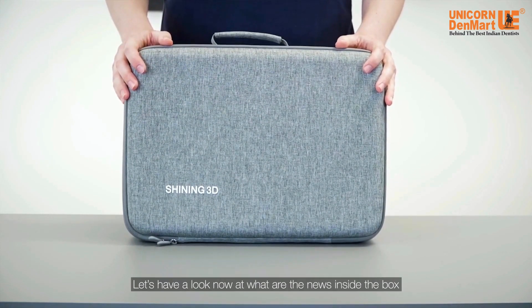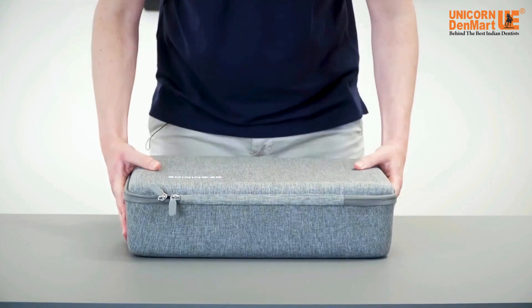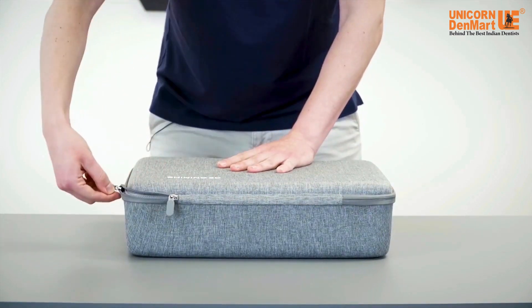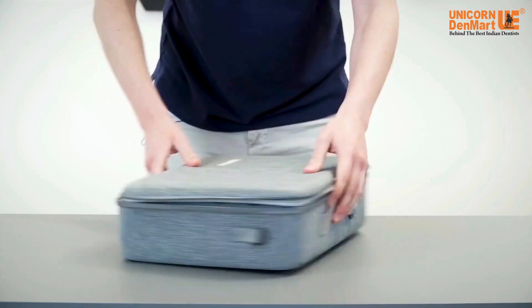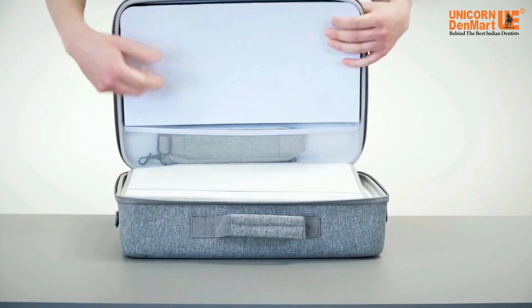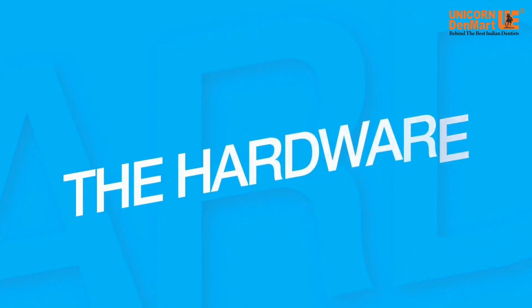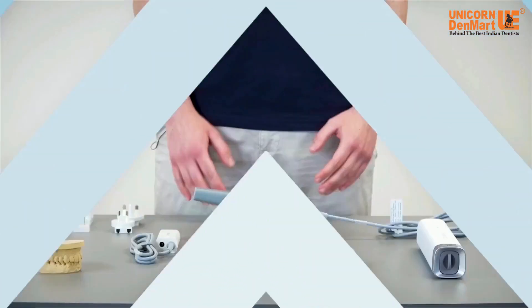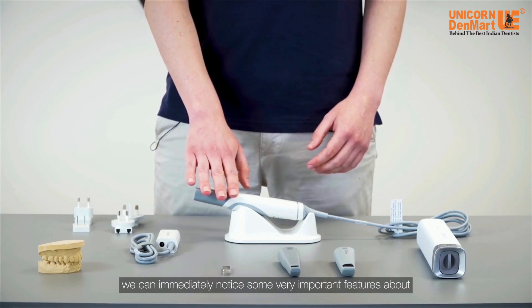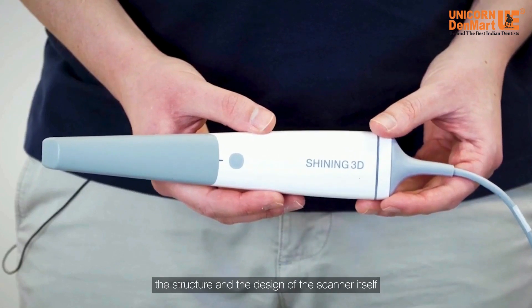Let's have a look now at what are the news inside the box. First of all, we can immediately notice some very important features about the structure and the design of the scanner itself.